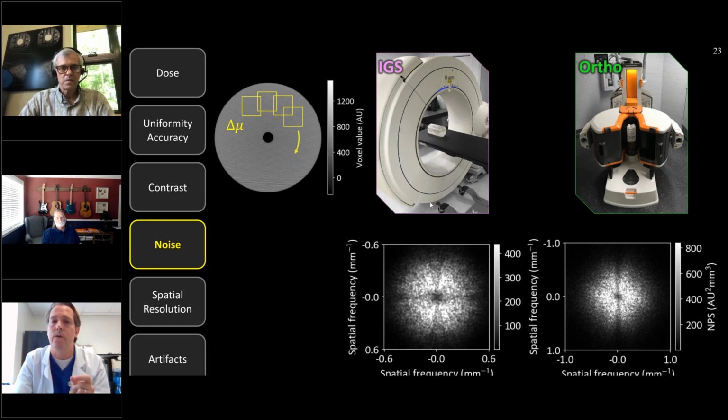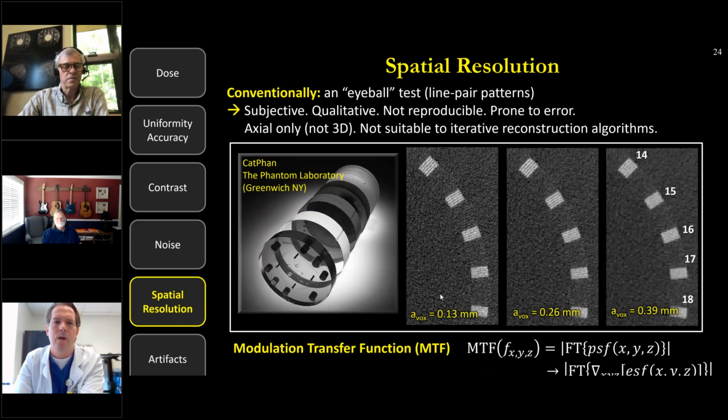So for example, if one of these pulsed fluoroscopic tubes is starting to arc or missing frames or something like that, sometimes those can be a little bit difficult to see visually, but very conspicuous in an analysis of the noise power spectrum, where you would see a streak pop right out as something anomalous, something in the system has changed, the repeatability of the tube is failing or something like that. So it's actually a pretty good constancy check as well.